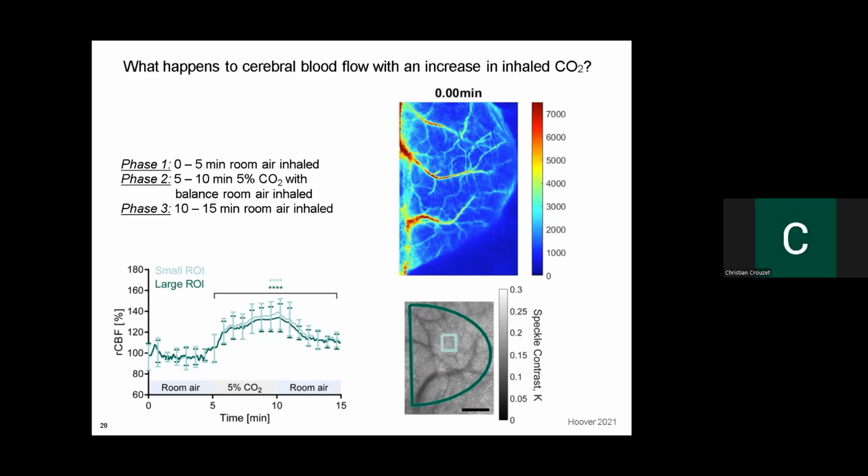We extract the flow information, plot it as a function of time, and from the time course data we extract a single value, and that's what we use for the baseline, in this experiment from 0 to 5 minutes. Does that help? Maybe we can talk a little more about some of the nitty gritty.